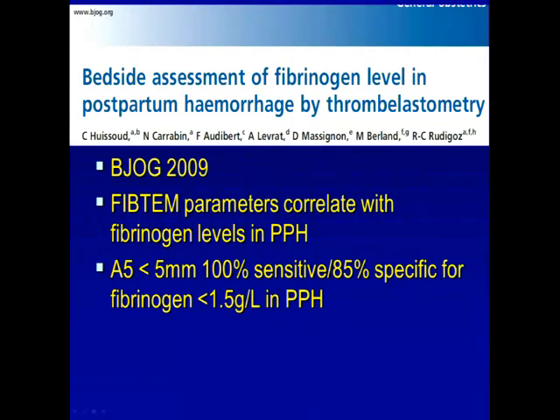and then you would move to coagulation testing guided parameters and resuscitation. But what ROTEM allows you to do is, within probably half an hour or an hour of getting the patient and stabilizing them, catch up very quickly and move faster towards targeted therapy with specific products rather than continuing on a fixed-ratio shock pack type resuscitation.